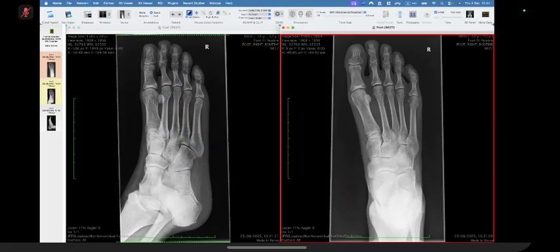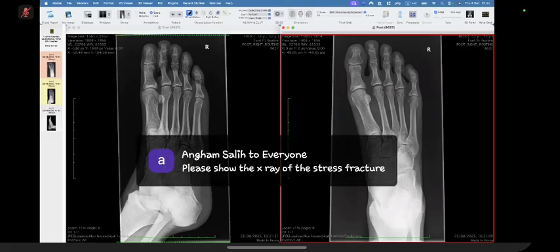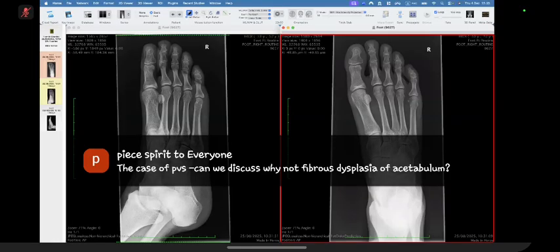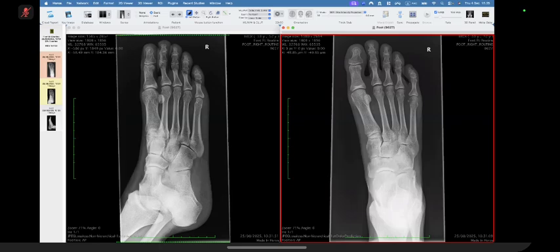When you say shorts, I don't know what you mean. Actually, they have changed the system from June 25, and now we are presented with 25 pathological x-rays instead of rapids. And what are you supposed to write? We are supposed to give the description, all the findings, diagnosis, differential diagnosis, and management according to our diagnosis. So if we don't get the diagnosis right, we are going to mess up the management in any case. I don't think it would be right of me to actually give you a definite answer for this.